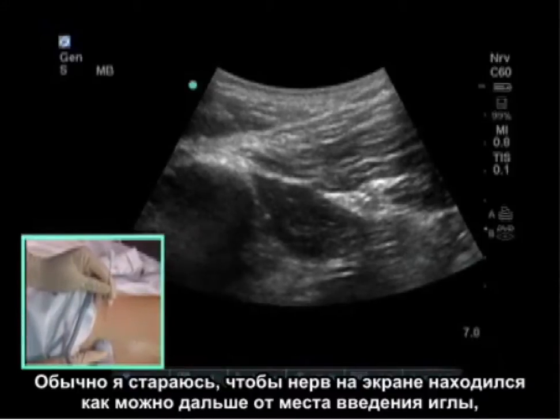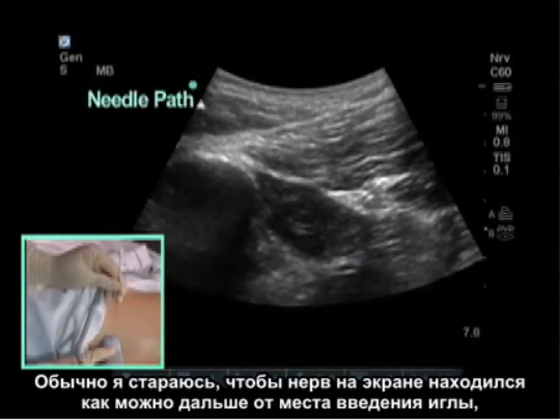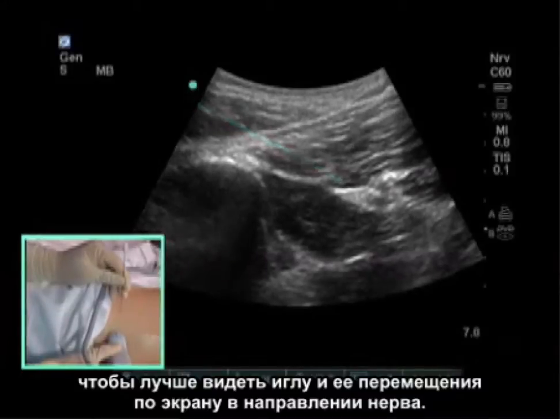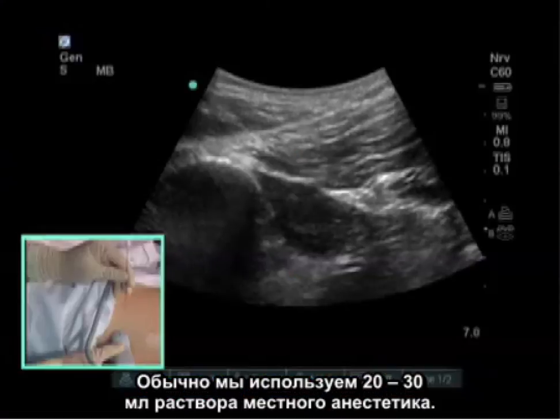I typically put my nerve on the distal side of the screen from where my needle is entering in order to see the needle better and traveling across the screen to the nerve. Typical volumes are 20 to 30 milliliters of local anesthetic.